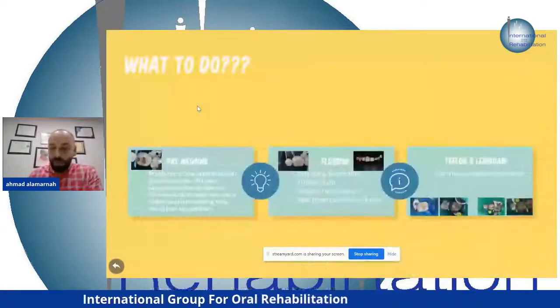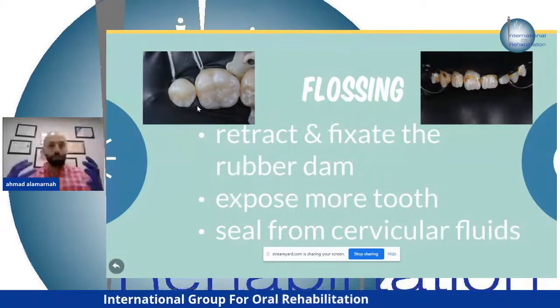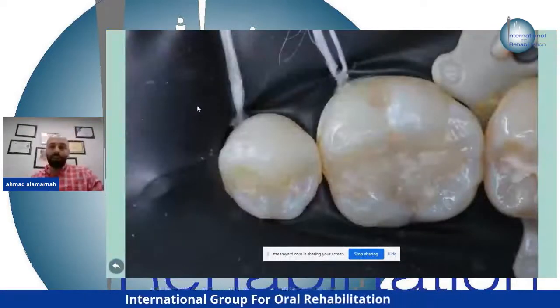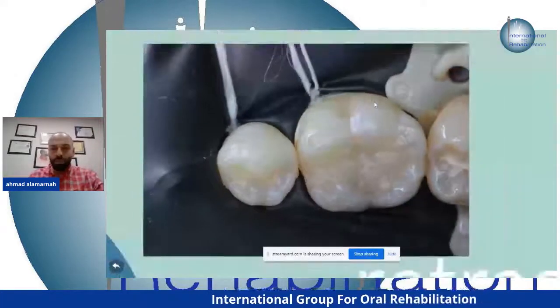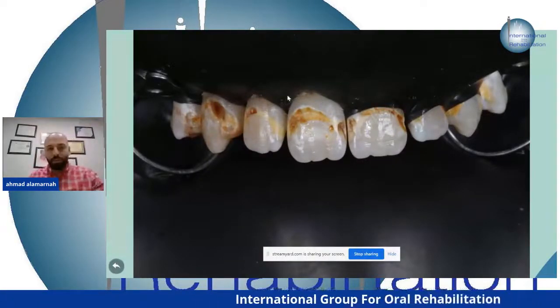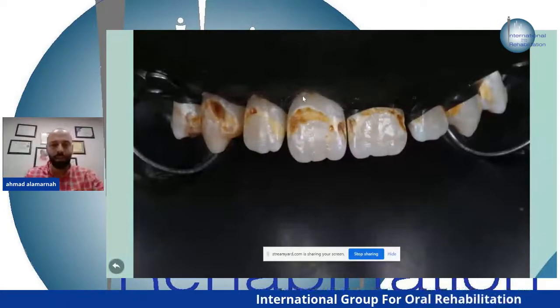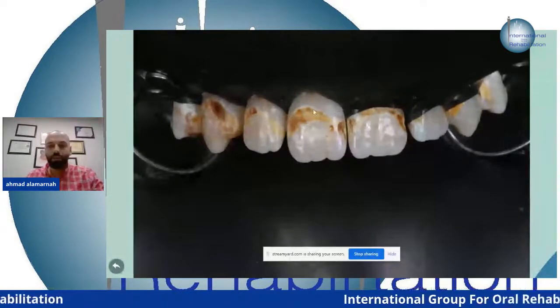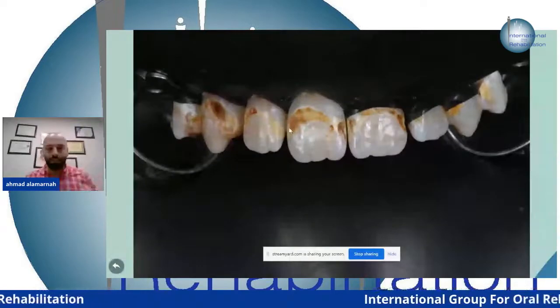Flossing before, as mentioned, exposes more of the tooth structure that you need to see and also seals from crevicular fluids. In this picture, look at the exposure — look at the cement-to-enamel junction here. This picture shows anterior teeth with and without flossing — look at the difference. It shows the caries and the healthy margins, so you can build your restoration on healthy enamel.